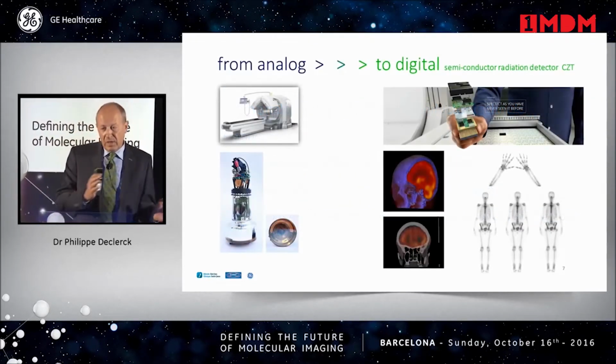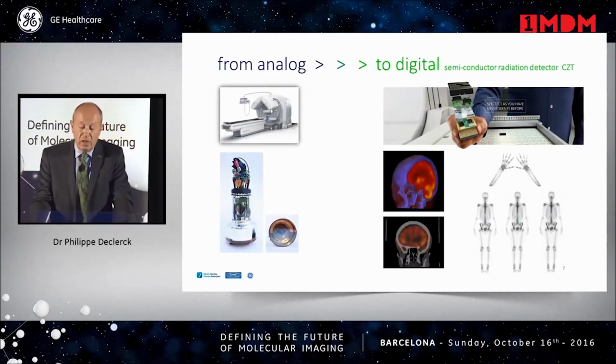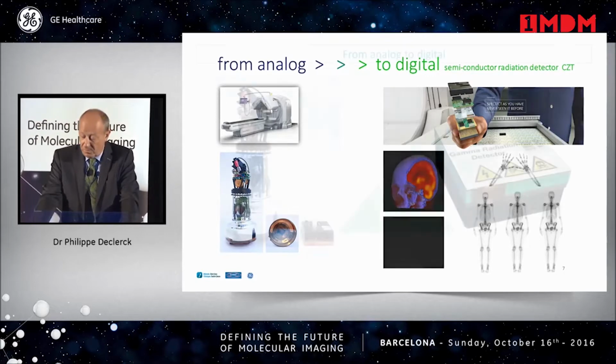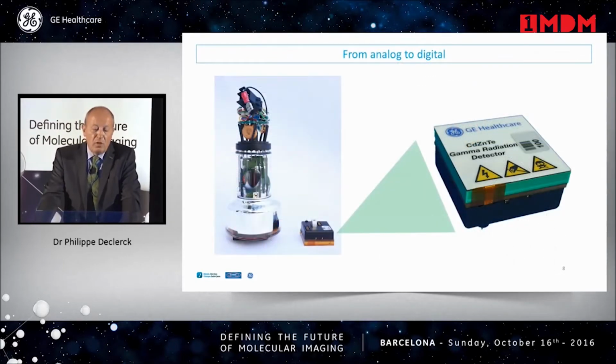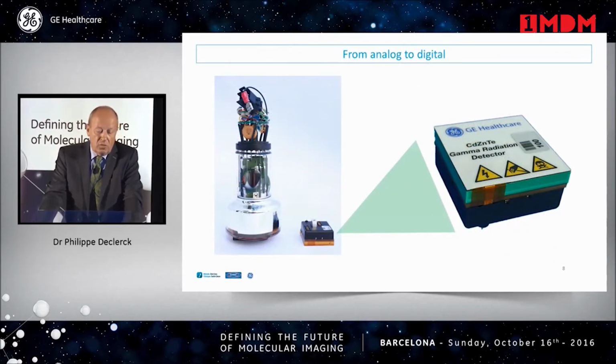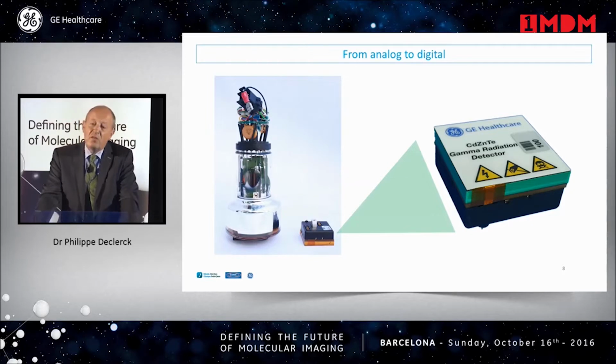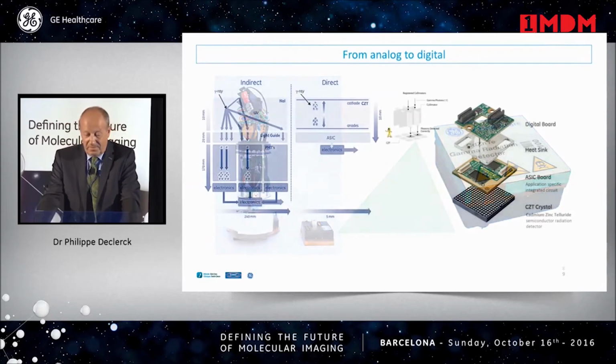So now we go from the analog age to the digital age with the semiconductor radiation detector, solid state detector. And you all know the old and good photomultiplier, and now we have this small, fancy solid state detector. You can see it on the boot, it's really small.